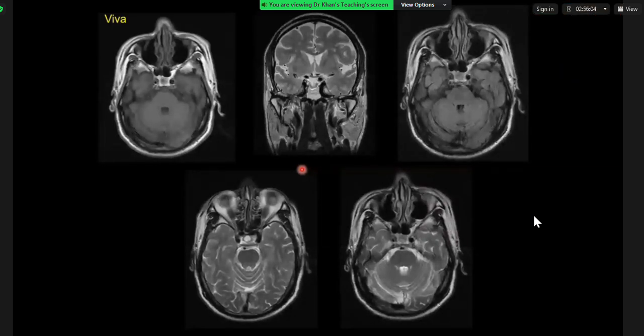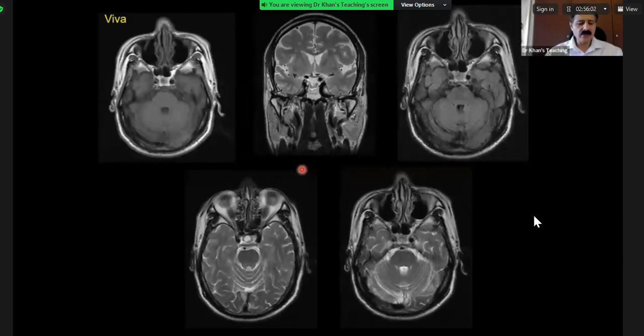Probably not. No. Okay, and I think in the next few cases dissection is coming. We'll cover it in detail. But having said that, dissection of the internal carotid artery is usually distal to the bulb within the neck, and it stops short of the carotid canal. Very, very rare for it to go into the intracranial portion. So just remember it like this.